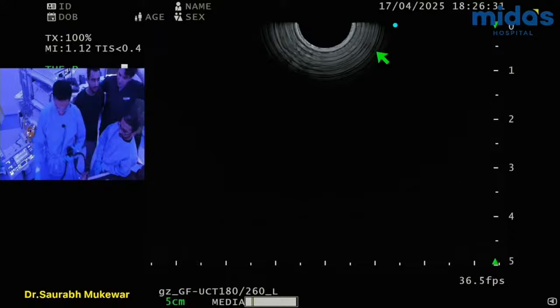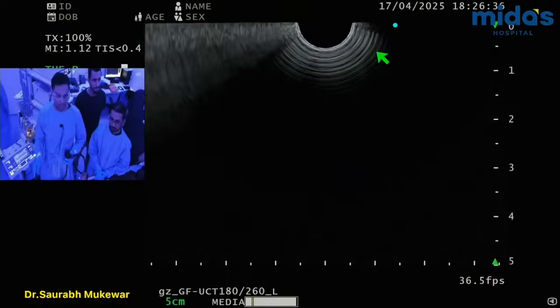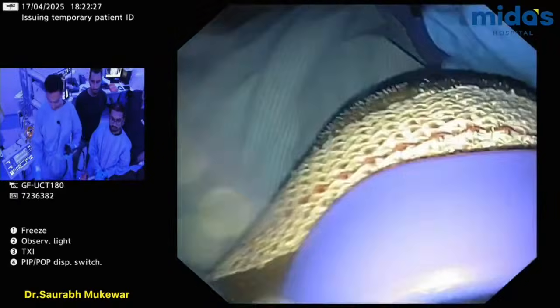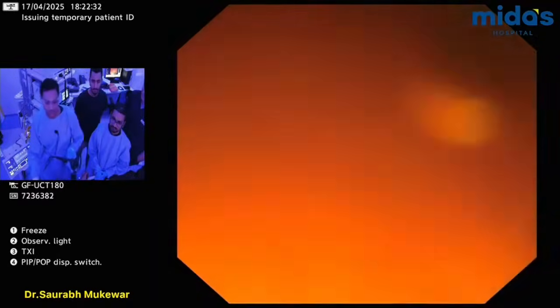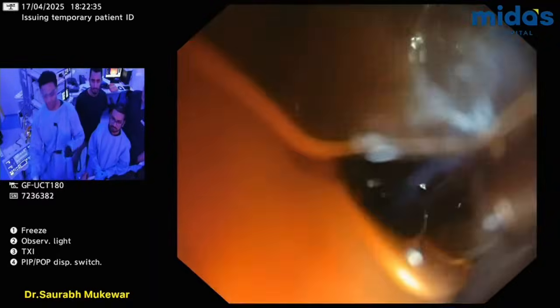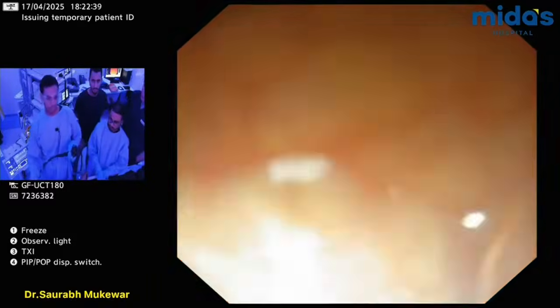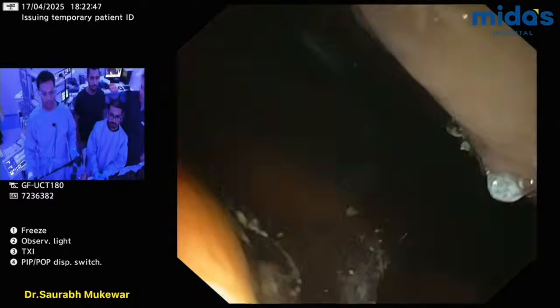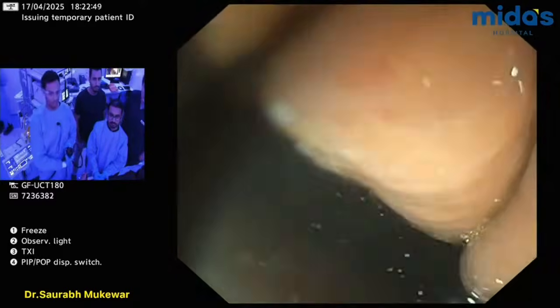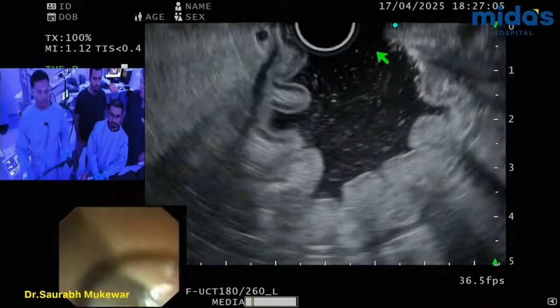Thinking in an acute situation, it's so different. With an EUS, you can just go in. What do you think is going to happen in the future? Like you can know that the patient with gastric varices is bleeding. You think this could be more effective, going down with the EUS, but we have to be sure that it's bleeding from the gastric varices, not from any other source. Or do you think we should go down just with the normal scope and then see? It's a matter of time, or best option?